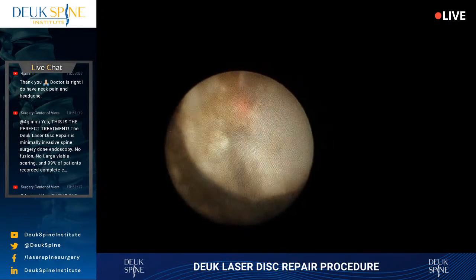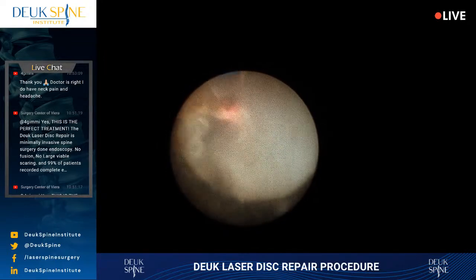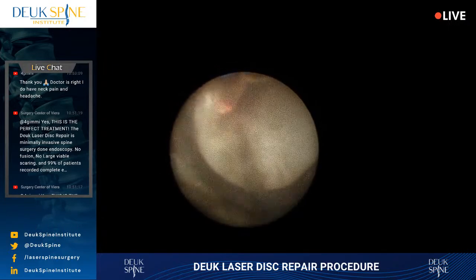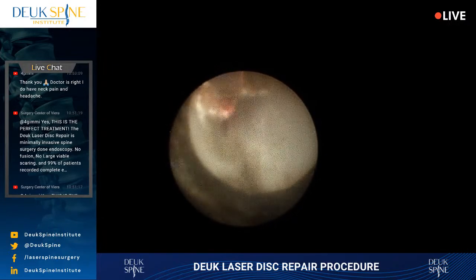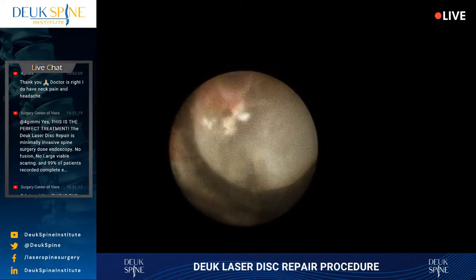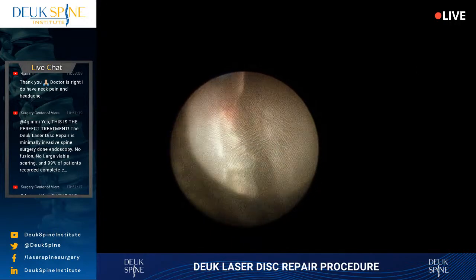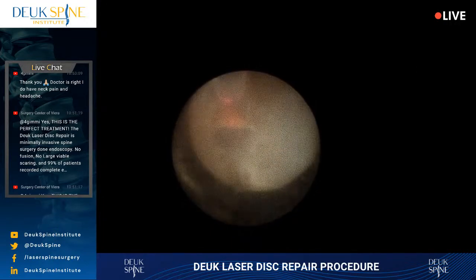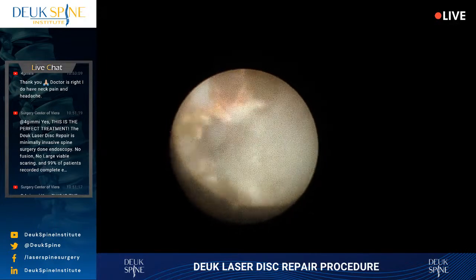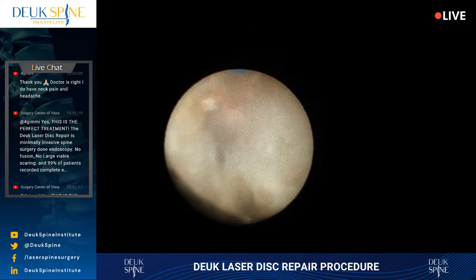So doing 5 disc surgery is very hard. It's very time consuming. It's physically and mentally demanding. And honestly, there aren't many surgeons that do it. So for somebody to say, hey, I'm going to fix all 5 discs in this patient because they need all 5 done, that's a big ask for a surgeon today. Now, I do it because I know that all 5 are needed, and I don't want the patient to have to come back for a second surgery. So I'll just do whatever's needed to be done during that surgery. Up to a limit of 5 discs, basically.